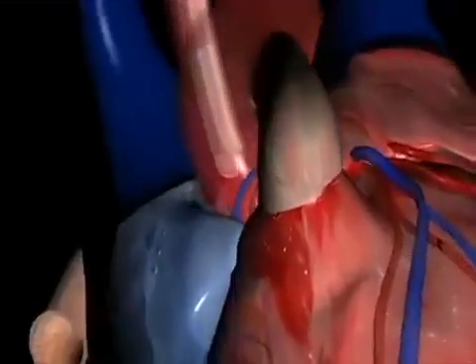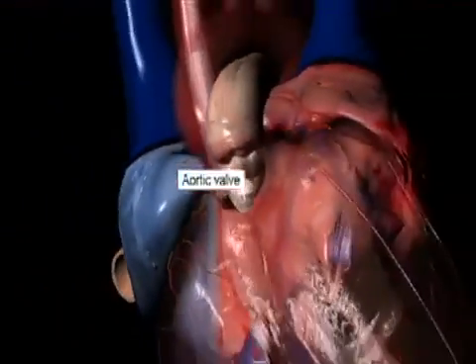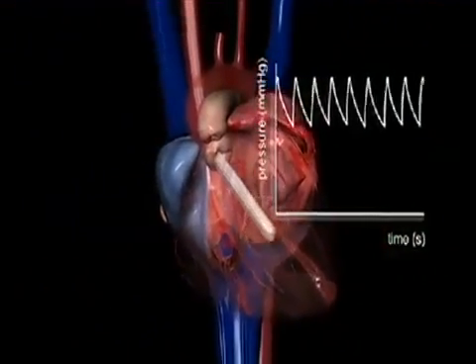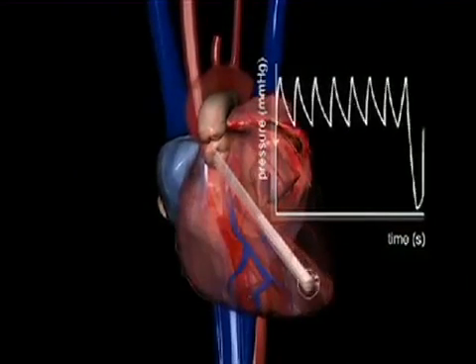To measure ventricular pressure, the catheter should follow a rectilinear pathway and pass through the aortic valve up to the ventricular chamber. The pressure waveform changes when the pressure sensor enters the ventricular chamber.